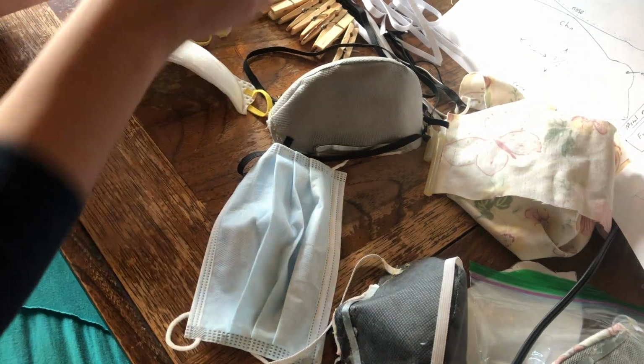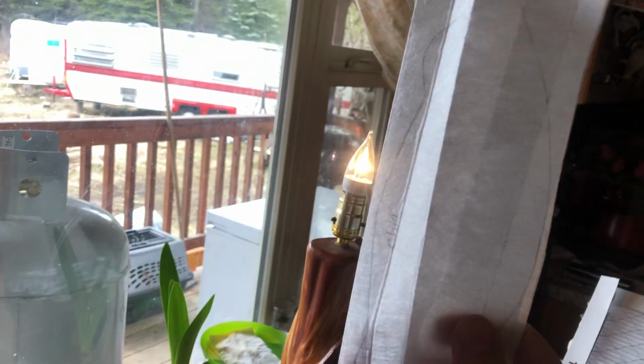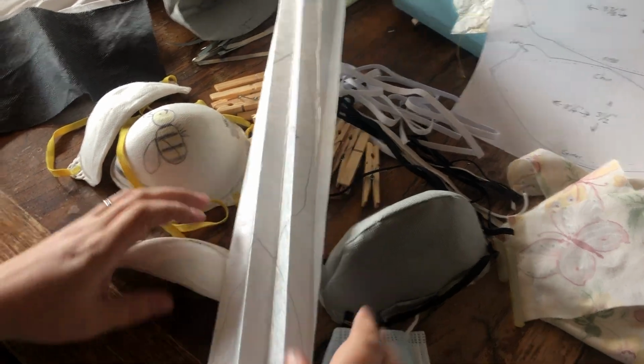Okay, so this furnace filter, here we go. What have we got? We have got a pressed fabric. Okay, that's good. This is going to be the thing that I'm trusting to do some good because it's been tested for the furnaces, and it's the only thing we've got really that's been tested here.